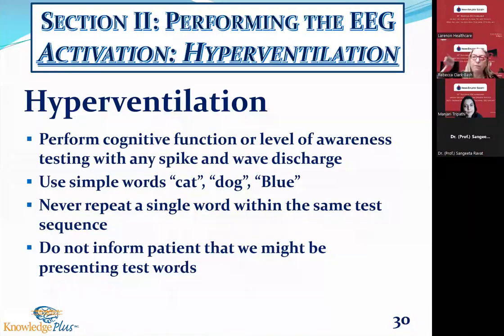When the epileptiform discharge has returned to baseline, then I say, Helen, what word did I say? And if they can remember the word, cat, you said cat, I make a note of that for neuro, saying they were conscious during their episode. Or if I say, what word did I say, Helen? And Helen says, you told me to do the deep breathing exercise. She didn't hear cat, thereby validating that there was no awareness during the event.